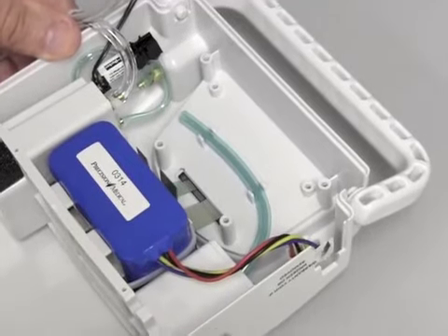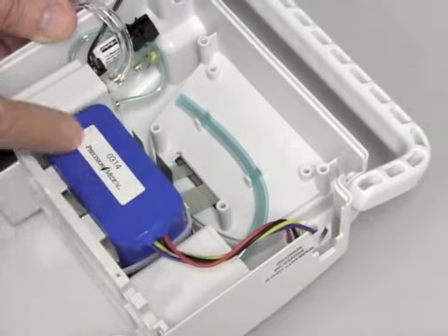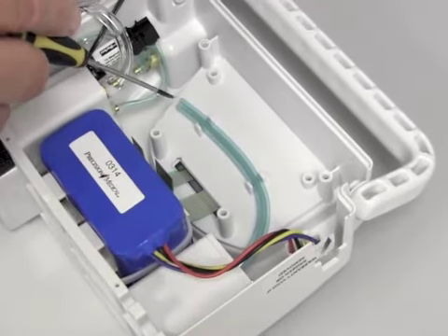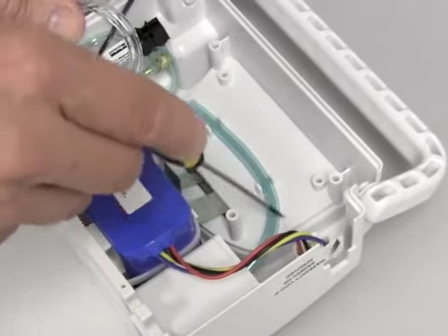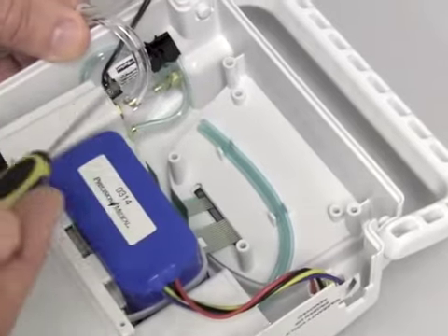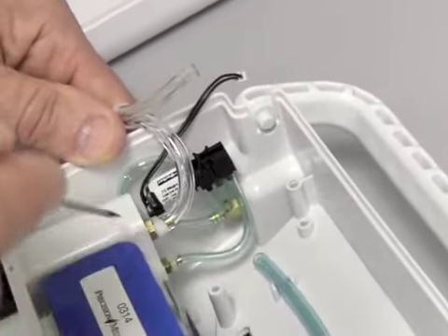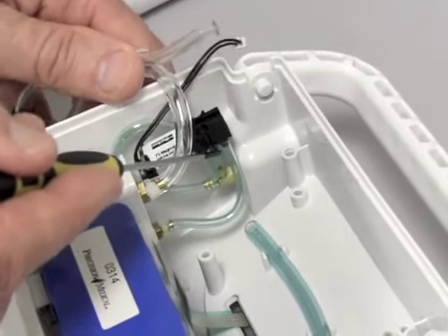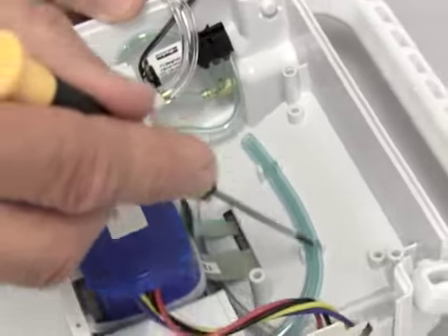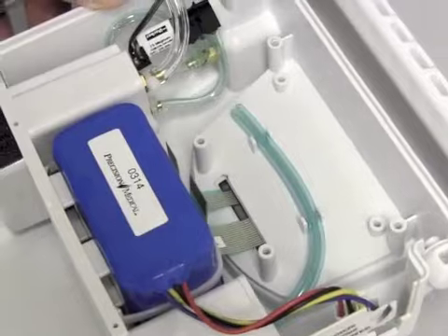The next step in disassembling the POC is to remove the reservoir assembly that also contains the battery. To do this, you have to disconnect 2 pieces of Tygon. This is the inlet for the air that's pulled into the POC, and this is the sensor tubing, the Tygon tubing that goes into the reservoir. So you have to pull the Tygon off of this valve, and you have to pull this Tygon out of the slots that hold it in place on the POC.